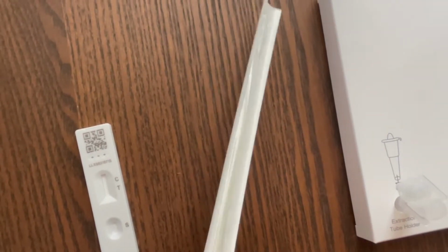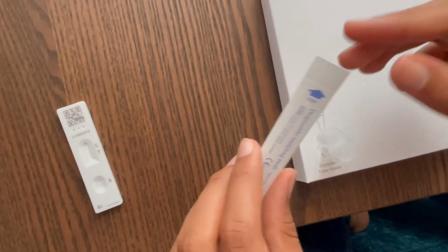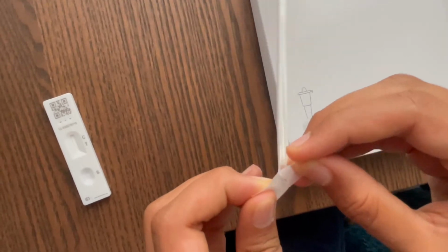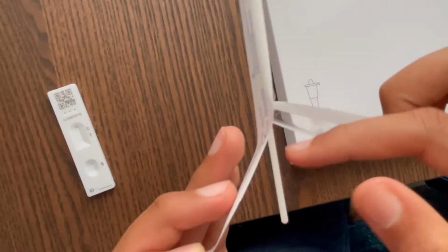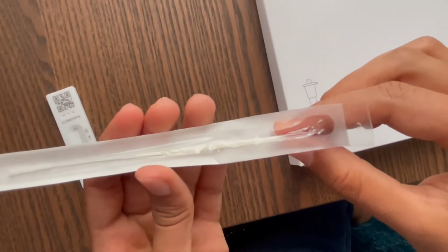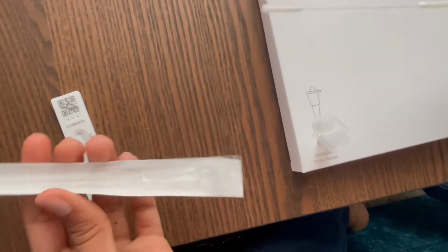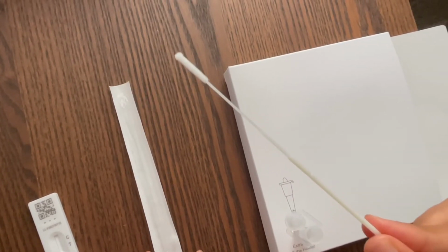We peel the swab from here. It's very clearly marked open, and we open it from here. We've got some clear plastic. There we go. So we need to hold this bit and get it out very carefully, making sure not to touch it anywhere else except your nose and mouth. Let's now go and do that.